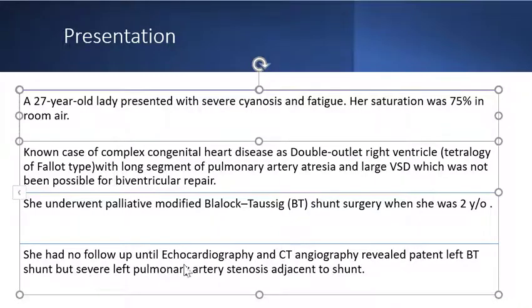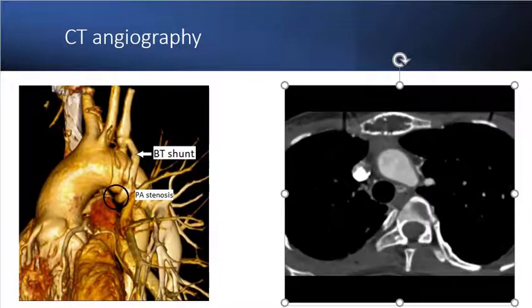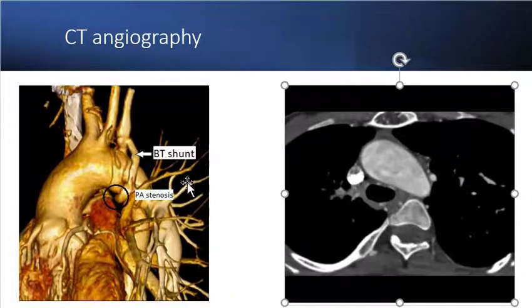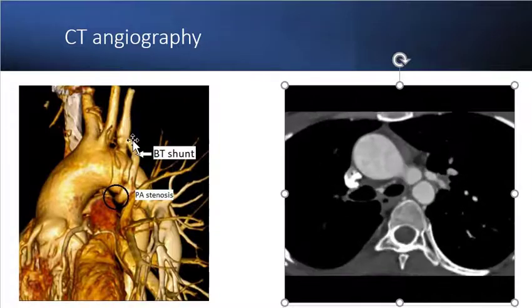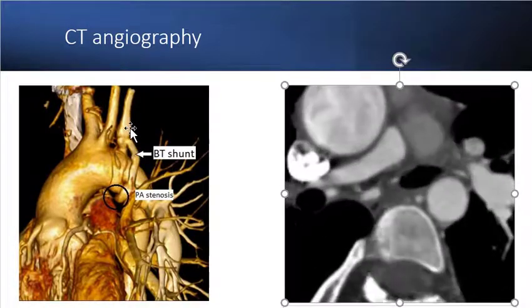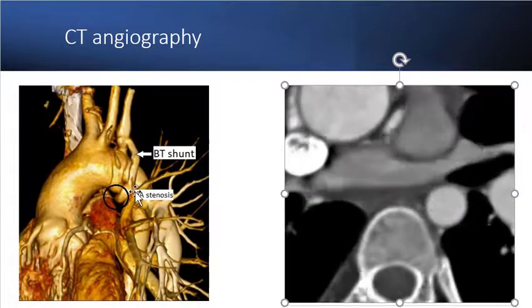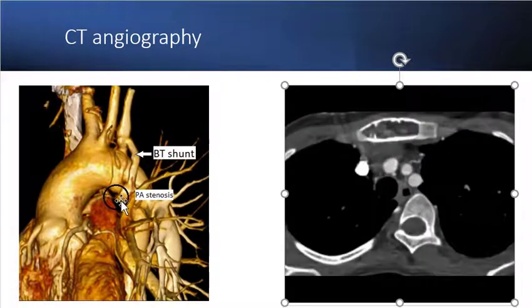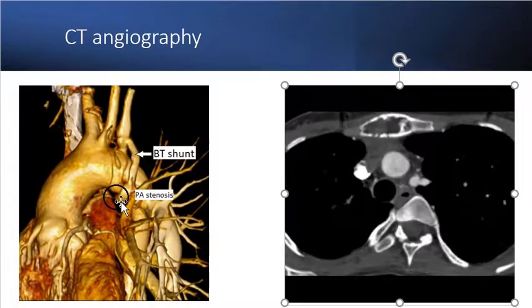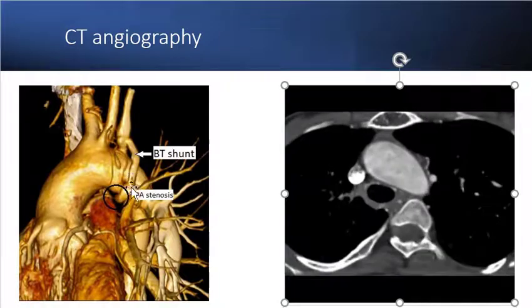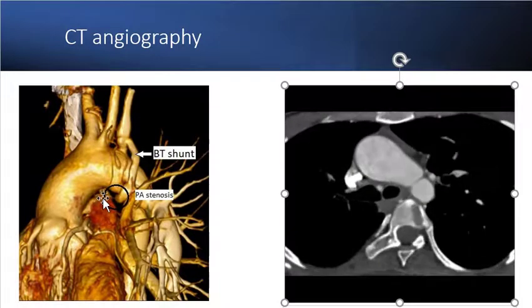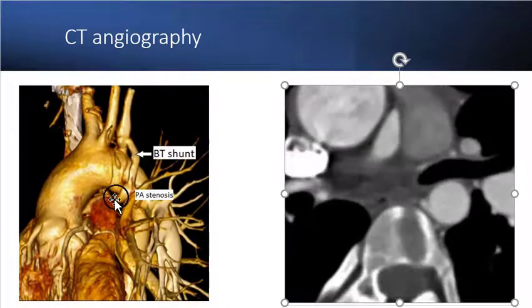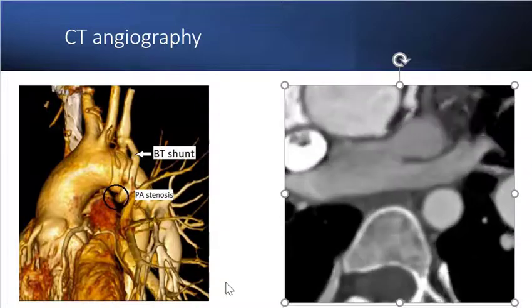She had no follow-up until echocardiography and CT angiography revealed patent left BT shunt but severe left pulmonary artery stenosis adjacent to the shunt. You can see the CT angiography findings. This is the left subclavian artery, and this is the BT shunt from the left subclavian artery to the left pulmonary artery. The severe stenosis of the left pulmonary artery between the insertion of the BT shunt and the PA bifurcation is evident. This stenosis prevents blood shunting to the right pulmonary artery.